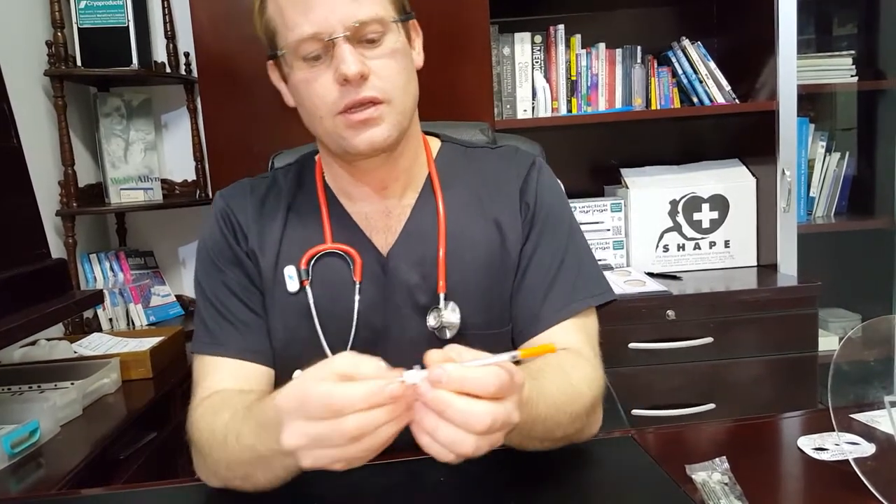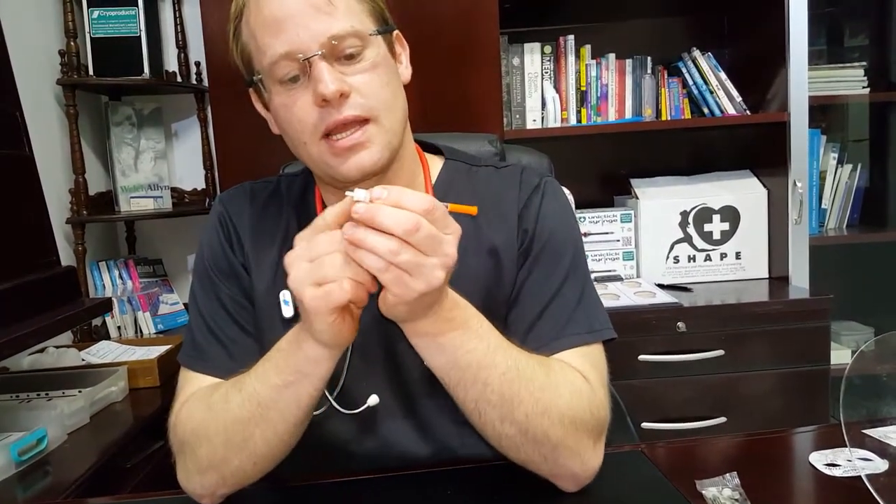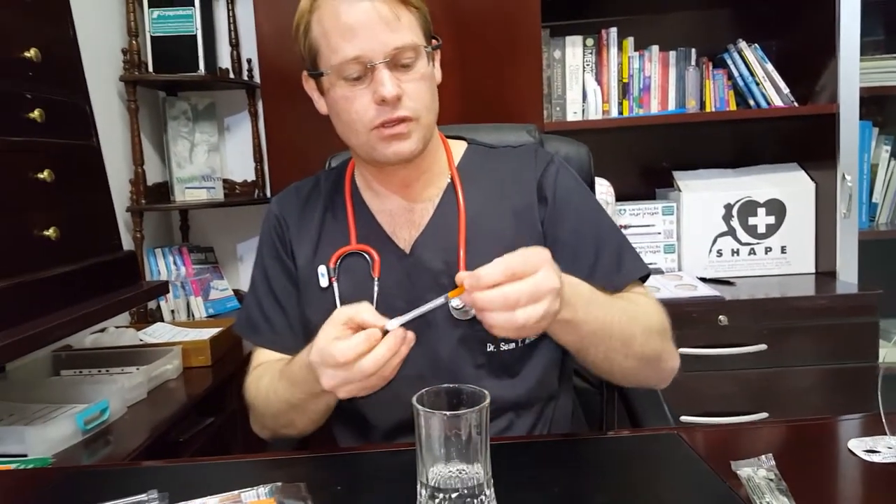It's quite simple to use. You'll see you have your little S-Tab at the top that can be used for drawing up. Take your front cap off — you've got your 30 gauge 8mm needle.